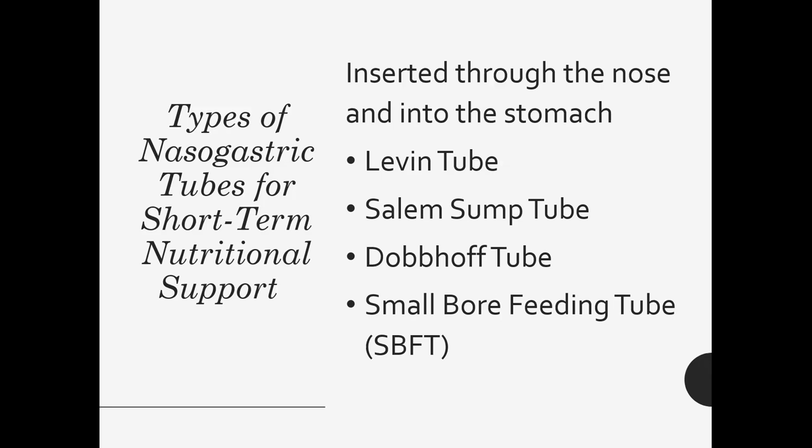Okay. There's different types of nasogastric tubes for short-term nutritional support. So most of the time, NG tubes are not long-term. It's just a short-term thing. You do see some people who have NG tubes chronically. Usually that's patients who maybe have eating disorders or something like that. But typically it's just for short-term while they're in the hospital. And we're going to talk about each one of these: the Levin tube, Salem sump tube, Dobhoff tube, and then the small bore feeding tube.